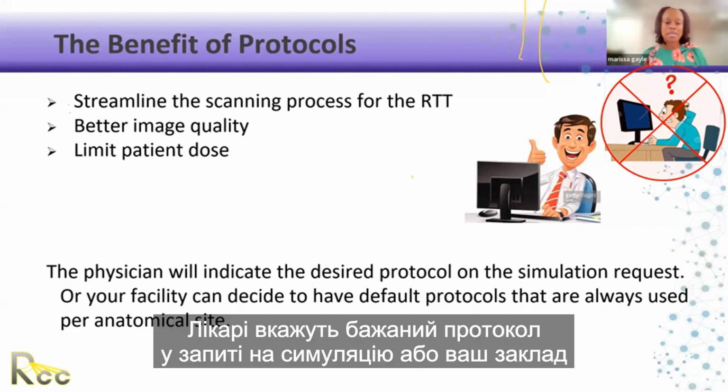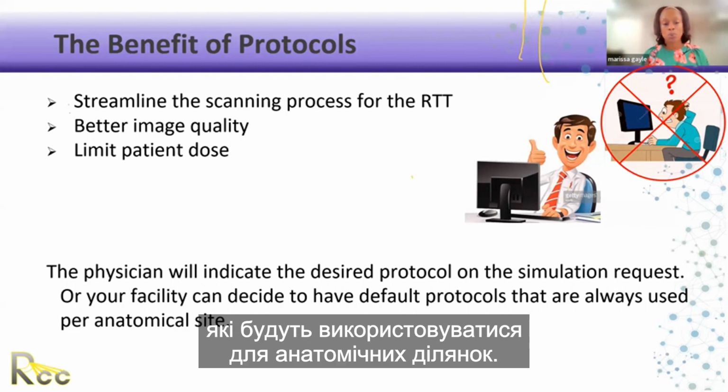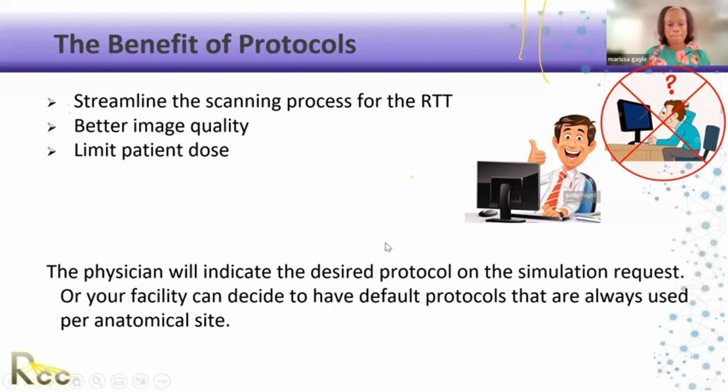The physicians will indicate the desired protocol on a simulation request, or your facility can decide to have default protocols that will be used per anatomical site.